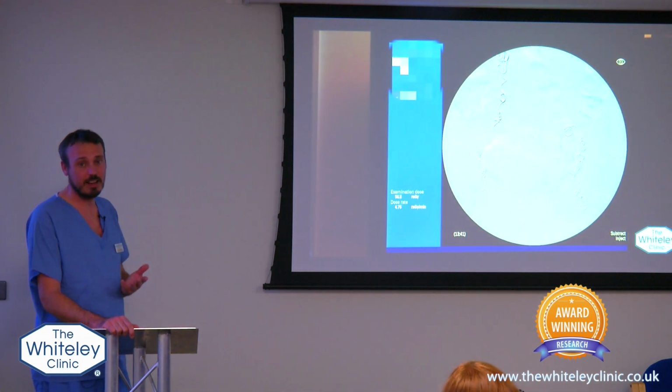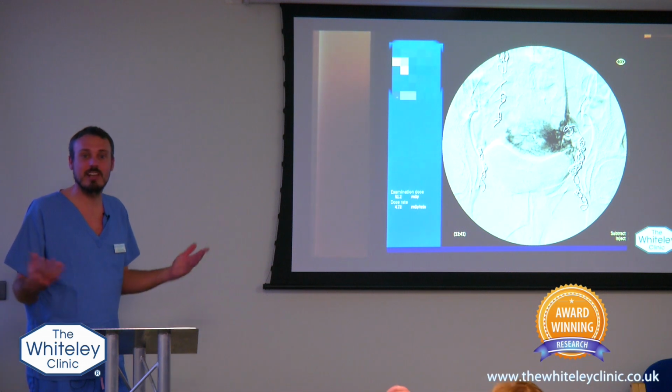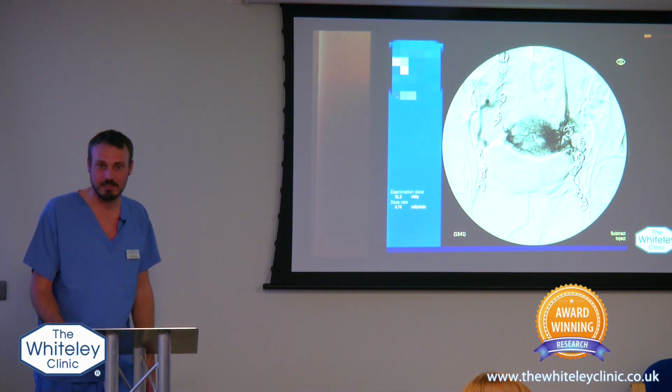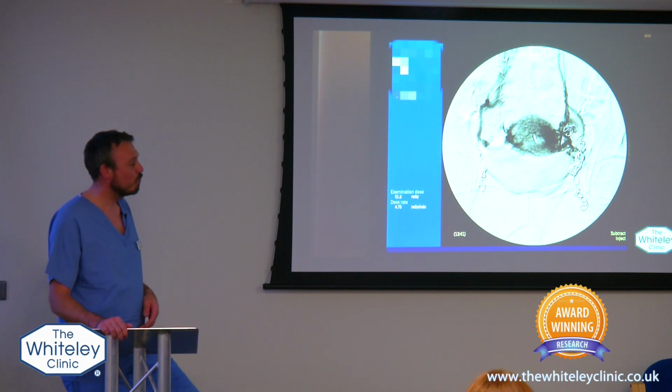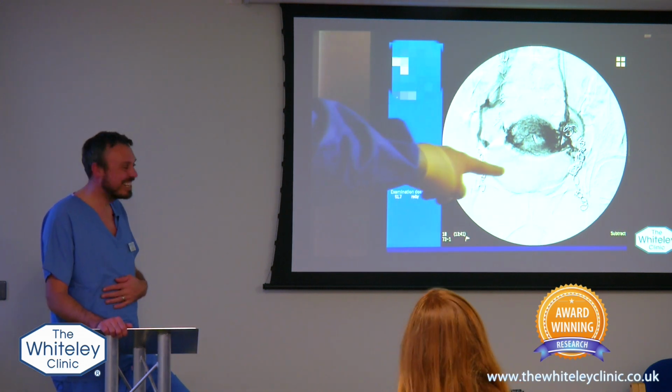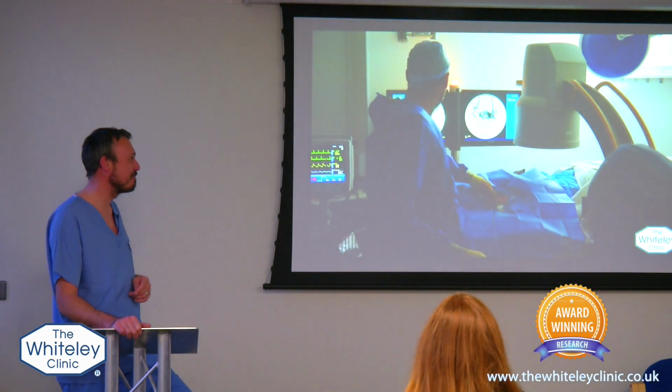And the other reason it's platinum these days is because everyone has an MRI scan at some point in their life. So everyone asks the question, can I have an MRI scan after this? And yes, you can. These are MRI safe. So someone carrying 30 coils around is worth a lot of money. Yeah, but they will not set a metal detector off either. They will not set a metal detector off.